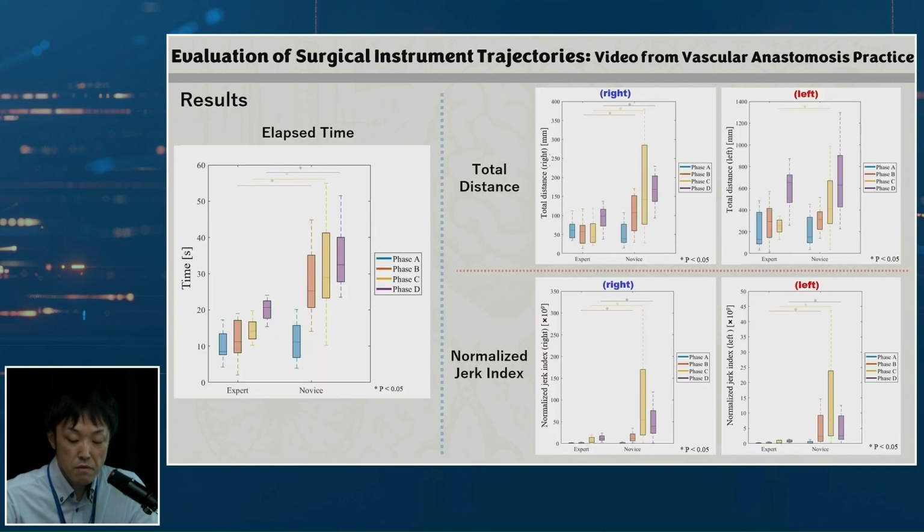This slide shows specific results obtained from the trajectory analysis of surgical instruments. The graph compares the expert and the novices. First, looking at the elapsed time, we can see that overall the experts, on the left side of the graph, complete each phase in a shorter time.